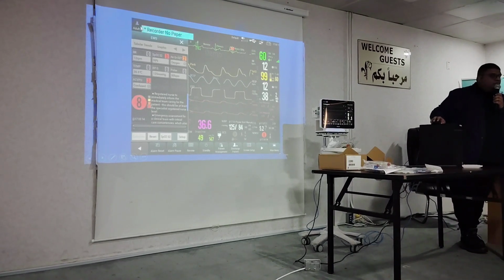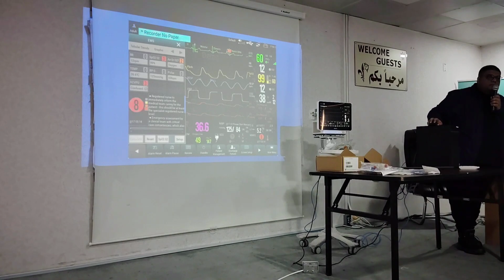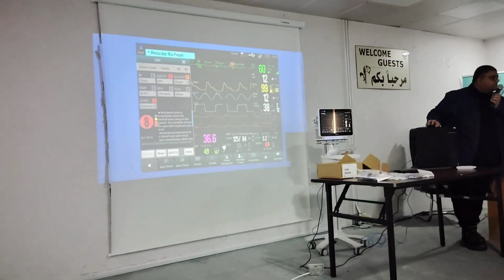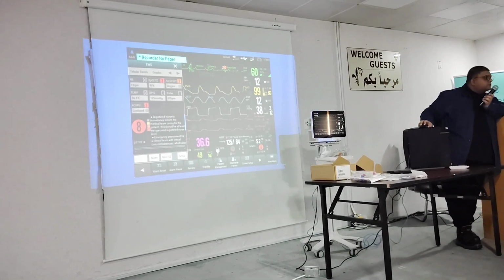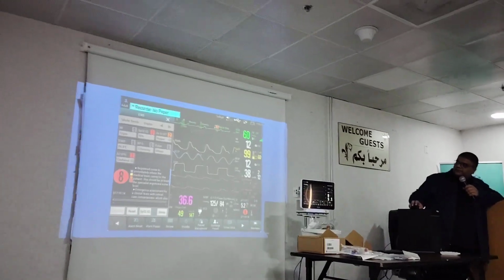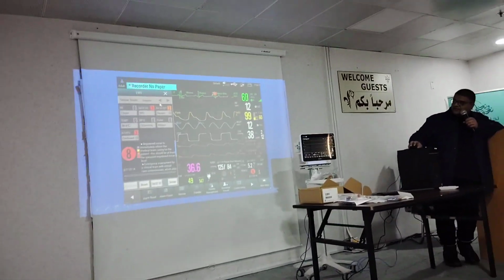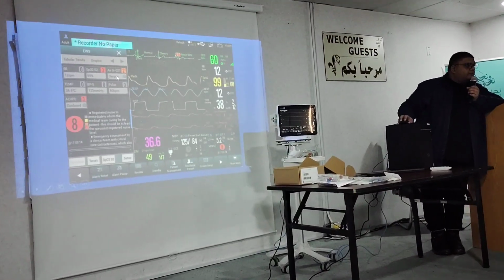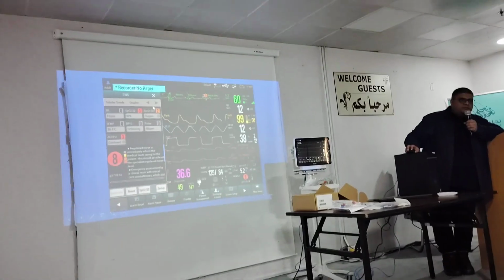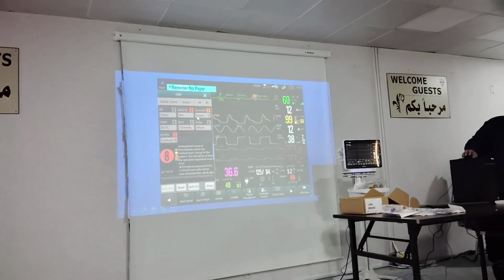And here is the early warning score. Do you use an early warning score here? Any kind of early warning score? Yes? Which one? MEWS, okay. We have MEWS over here. The one you're currently seeing on the screen is NEWS, the National Early Warning Score from the UK. It's the second version, the latest one so far. But we do have MEWS as well.